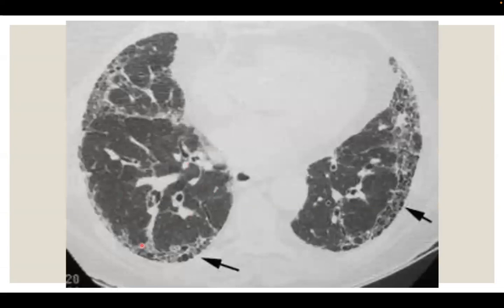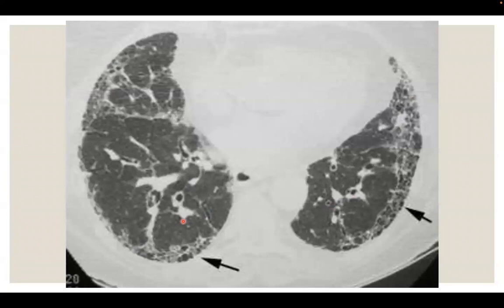Here is another example showing that the abnormality of honeycombing is confined to the periphery with no evidence of bronchocentric traction bronchiectasis or ground glass or irregular reticulation.